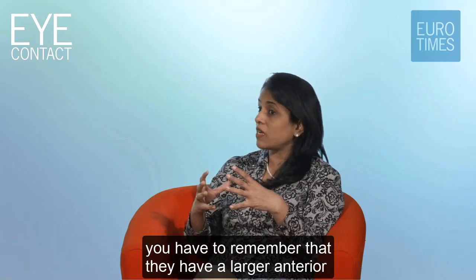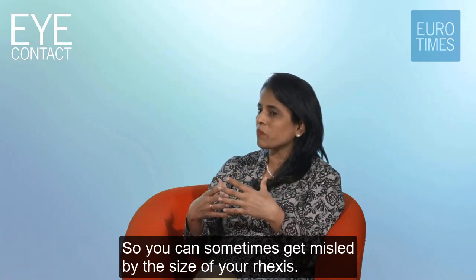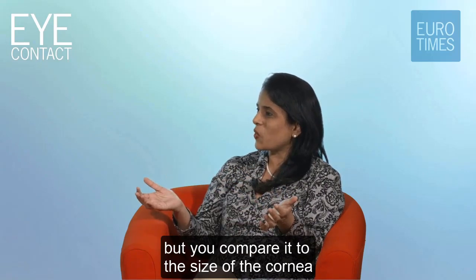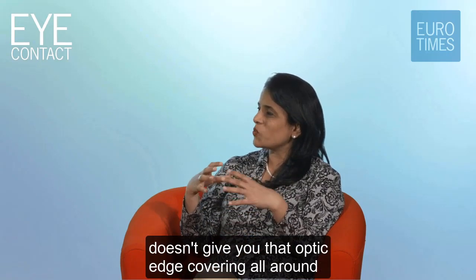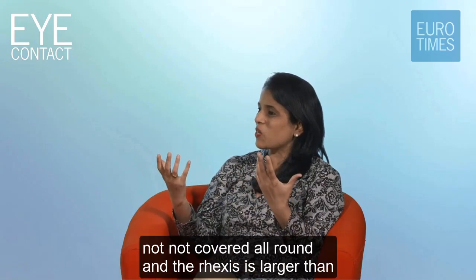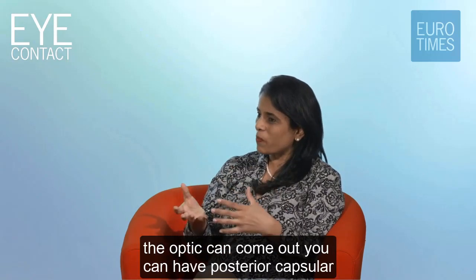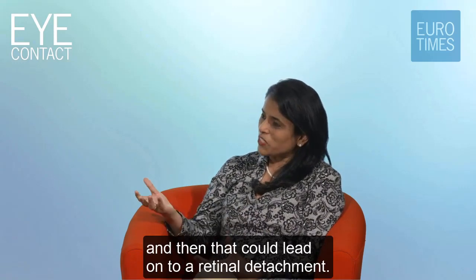You have to remember that they have a larger anterior segment, the cornea, so you can sometimes get misled by the size of your rhexis. You may make a normal size rhexis, which is the right size, but you compare it to the size of the cornea and you feel it's very small, and you may go ahead and enlarge it a bit more, and then you find that it doesn't give you that optic edge covering all around, and your optic is completely not covered all around, and the rhexis is larger than the optic. So these are problems that can happen, and if that happens, the optic can come out. You can have posterior capsule opacification. Post-operatively, you might have to do a YAG laser for that PCO, and then that could lead on to a retinal detachment.